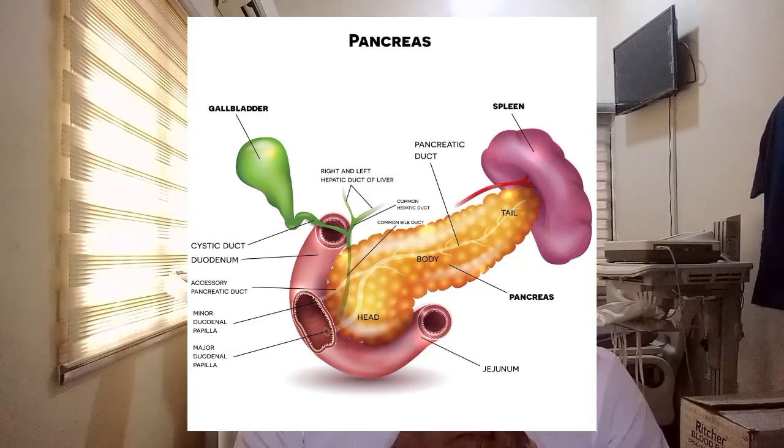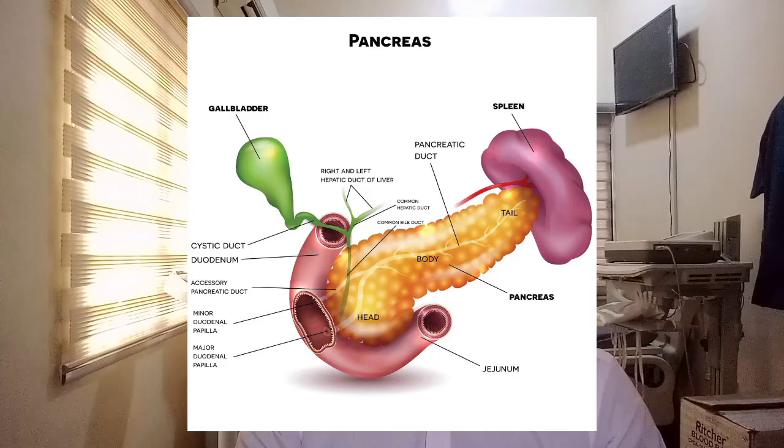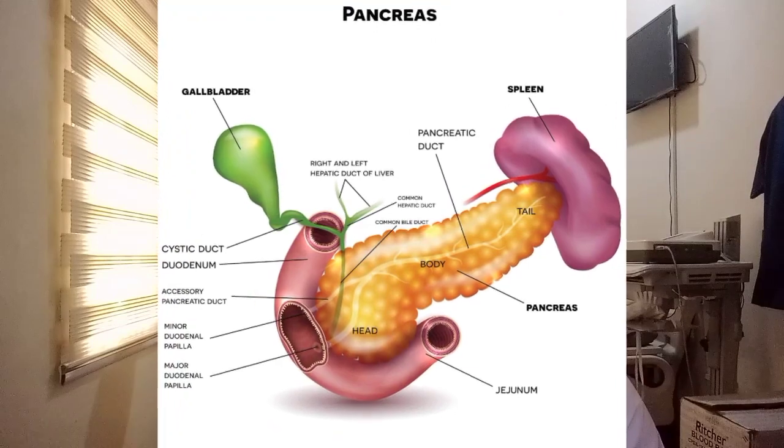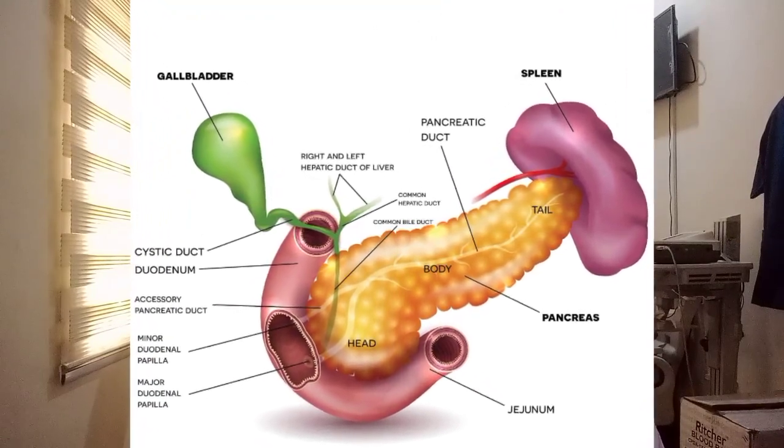The left border of the vertebral column is an arbitrary plane for dividing the body from the tail. The tail extends across the left adrenal gland and upper pole of the left kidney to end near the hilum of the spleen. It is most commonly found at or near the hilum of the spleen, usually. However, it may lie low in position near the upper pole or the hilum of the left kidney.